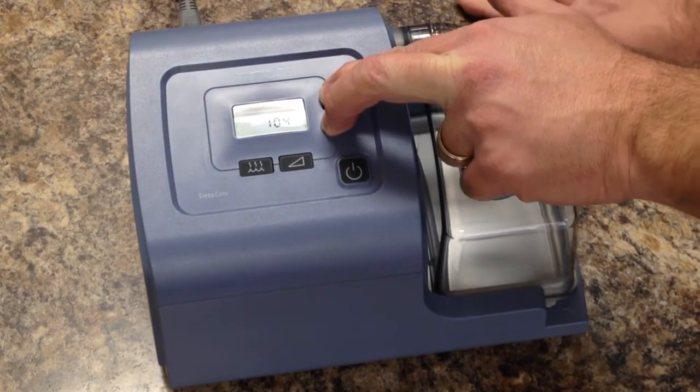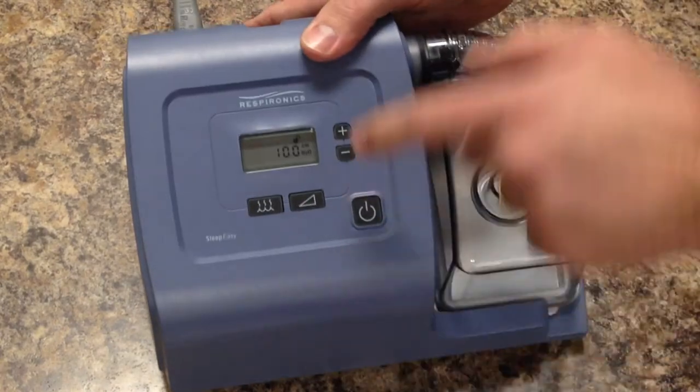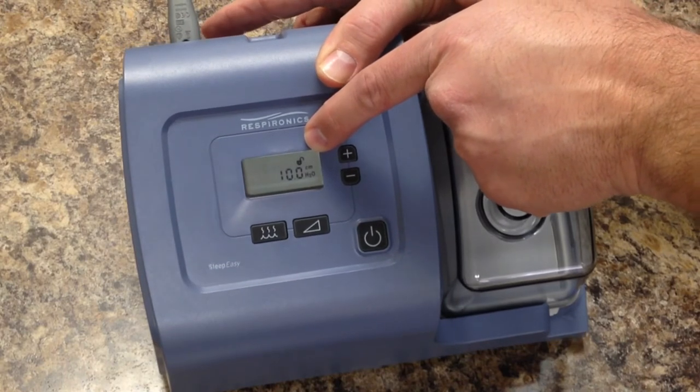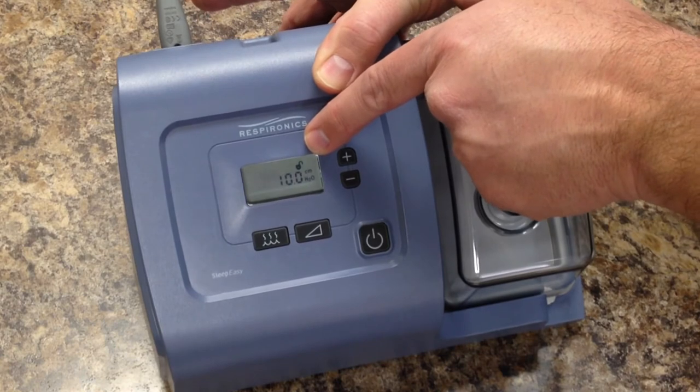Don't let go of those two buttons until you see the unlocked padlock on the screen. There you can see the small unlocked padlock symbol. From there, the machine is unlocked, and you can go in and look at all the menu items and make any changes.